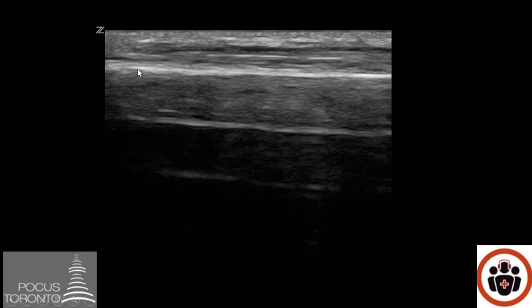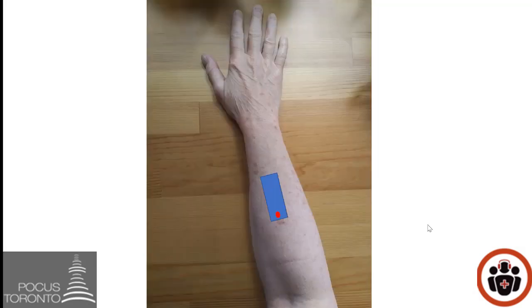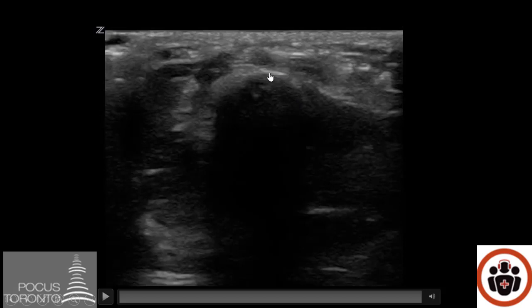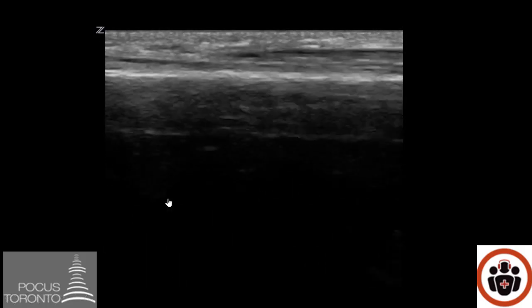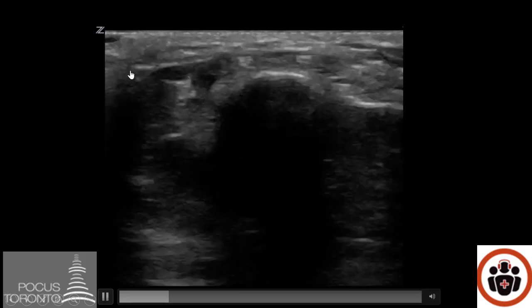How do you know which white line represents your bone when all three lines are white and go across the screen? One trick is to rotate your probe into the short axis. The short axis will get you a bone shadow far field to where your white bone is. Then as you rotate the probe back into the long axis, you can see that the white line at the very top of the screen is the one that represents our distal radius.